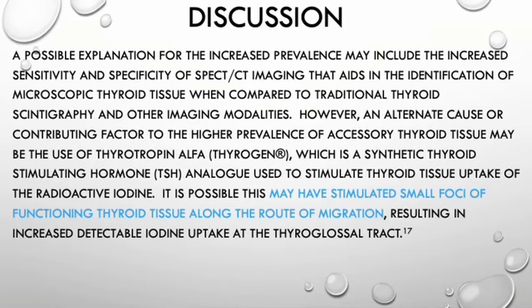So one possible explanation for this increased prevalence, of which we favor, includes the increased sensitivity and specificity of SPECT CT imaging.